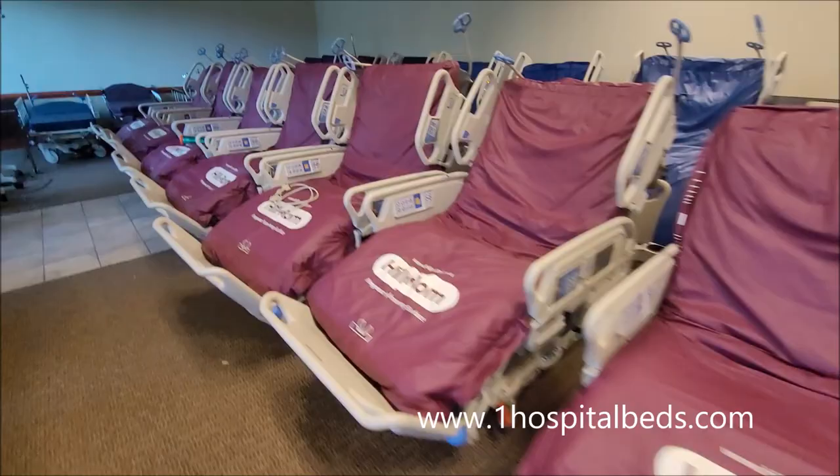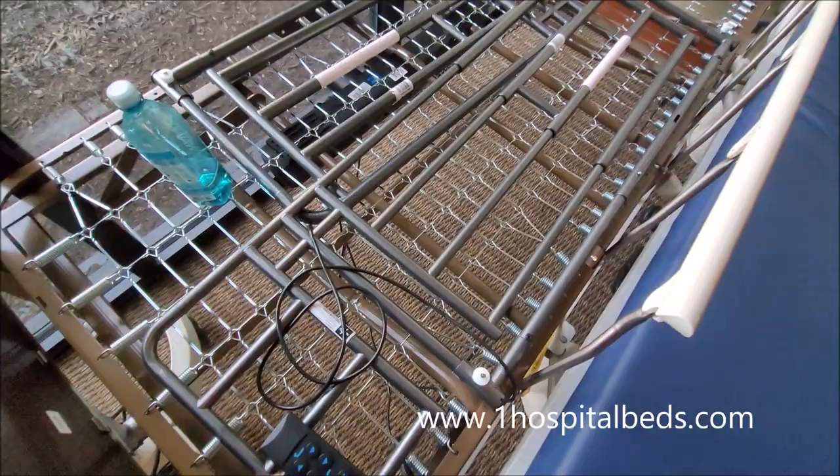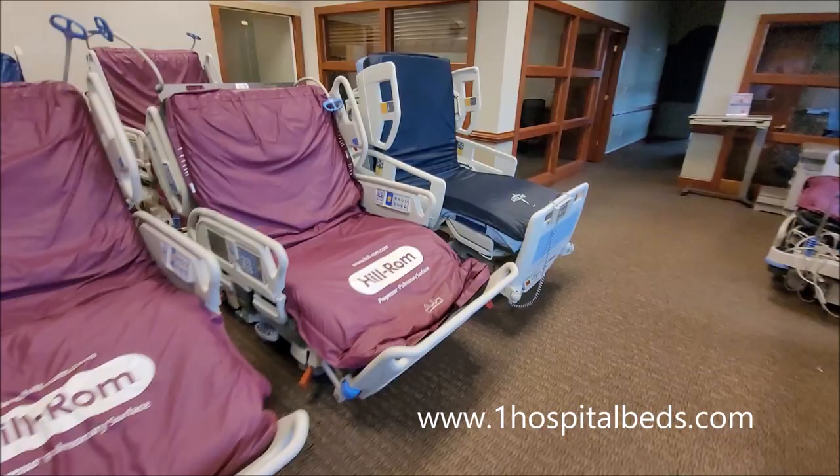And as you've seen from the videos that I do here, I'm just going to show you this again because it's really important, I think, to visually understand. This is what most people get from insurance. They get a bed with a rail system that is pretty much permanent. It's a spring, push it up and down, and then there's a place for a crank to lift it up and down. So basically the goal is to find a full electric hospital bed that's going to be comfortable, that's going to have all the features you need, and be priced right.